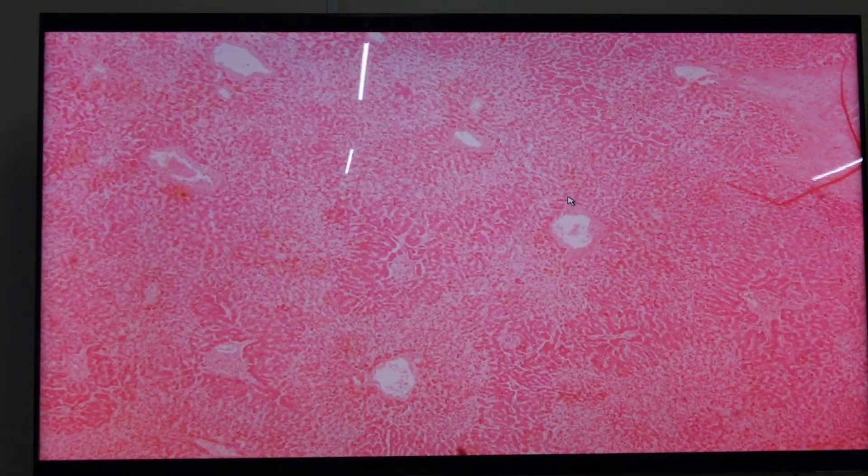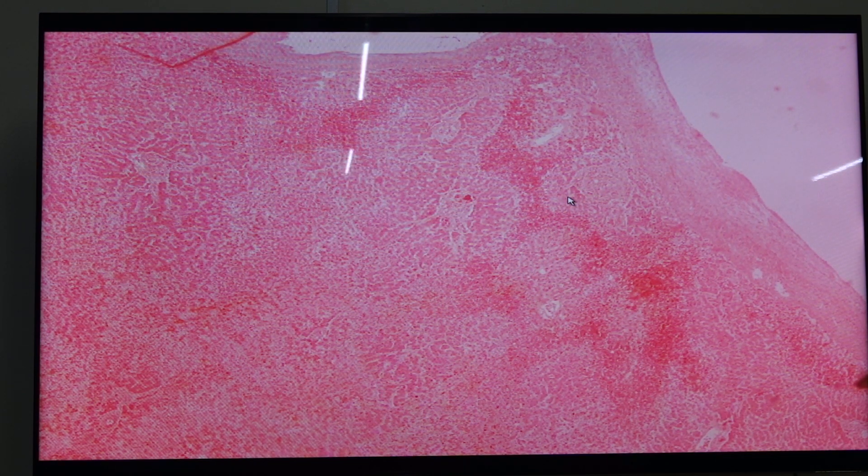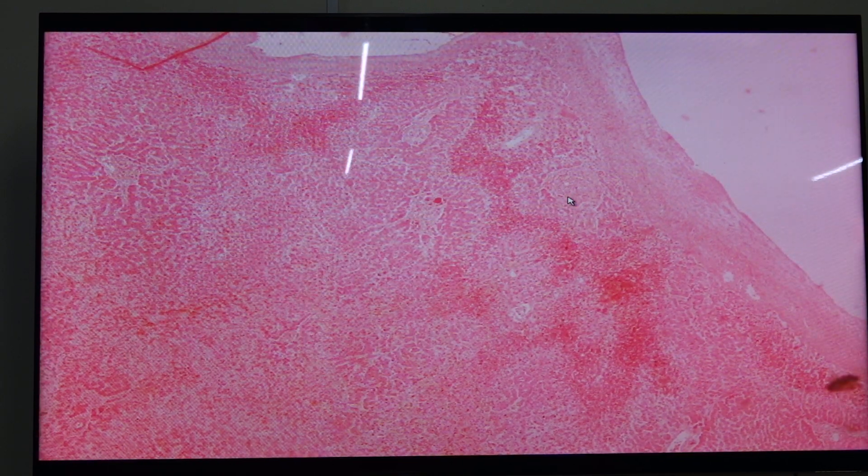Next is slide 126. We find this in cases of circulatory disorders like left-sided heart failure and shock. This is associated with hepatic central hemorrhagic necrosis, which involves the centrilobular zone.